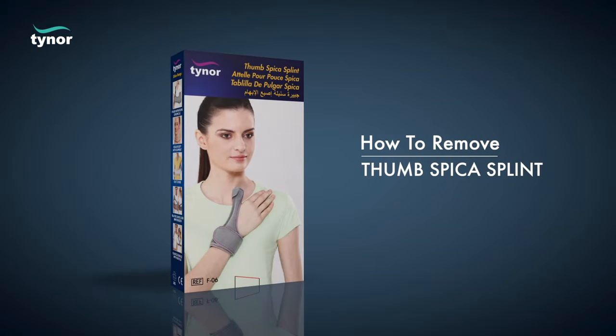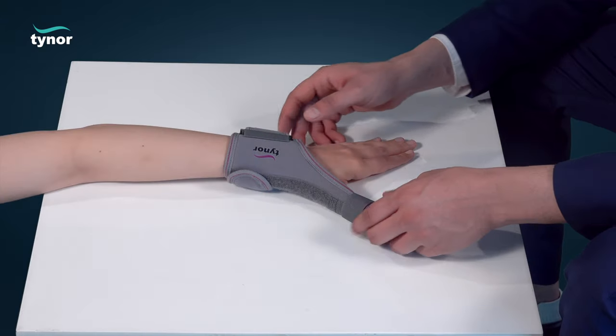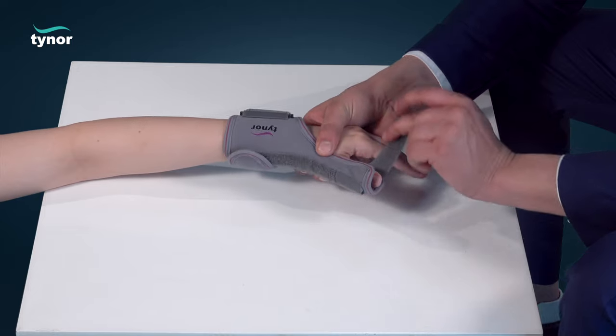Now let us see how to remove the thumb spica splint. Unfasten the fasteners to easily remove.